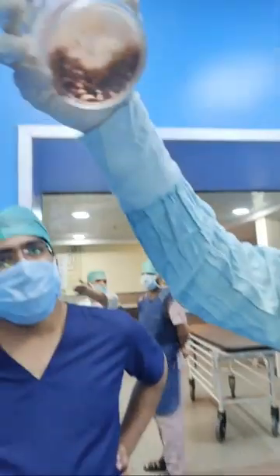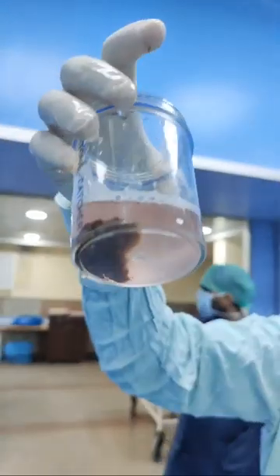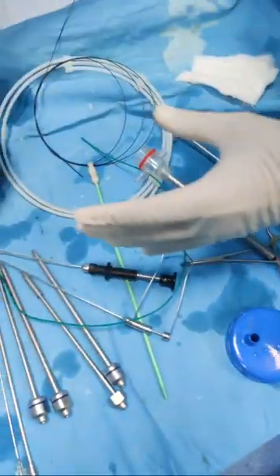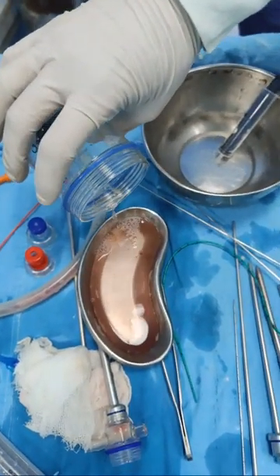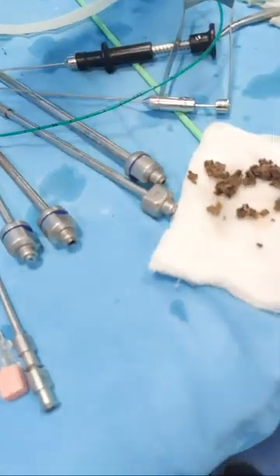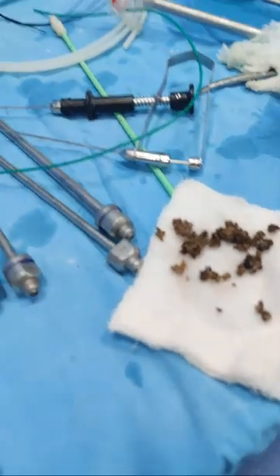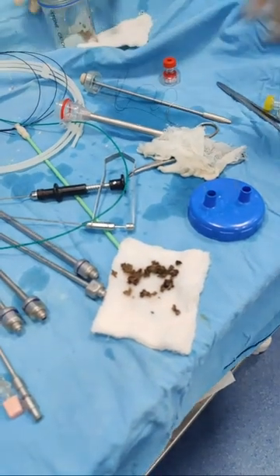Now you see. Can you see we have broken it into very small fragments? You can show from here. And if you want to show on the monitor. So we can take out all this with the 21 French track with minimal time.